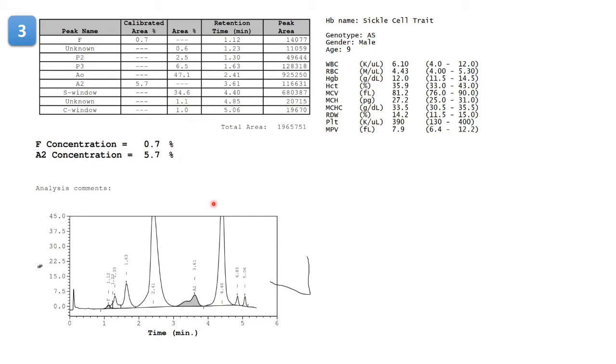However, you still need to exclude carryover or any other recent transfusion history in such small abnormal peaks which are coming here. Another thing to note in sickle cell hemoglobin, which I mentioned earlier, is that any post-translational modified products of any particular hemoglobin molecule will come before the actual peak.